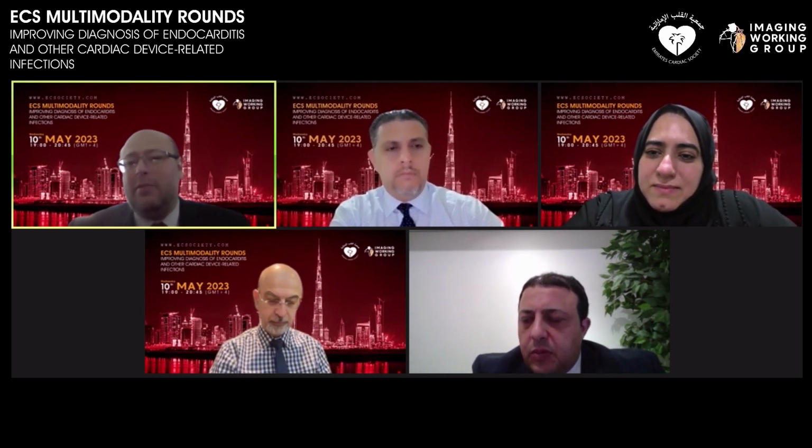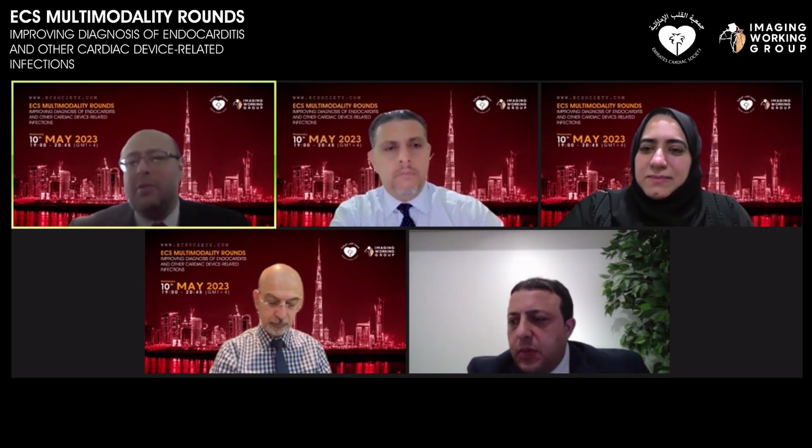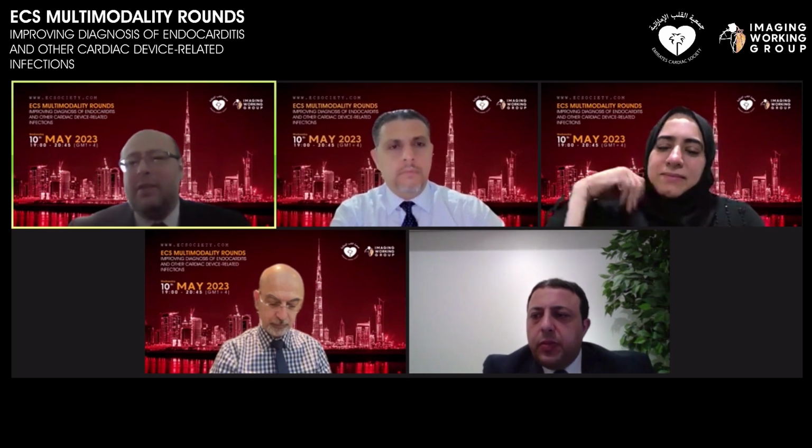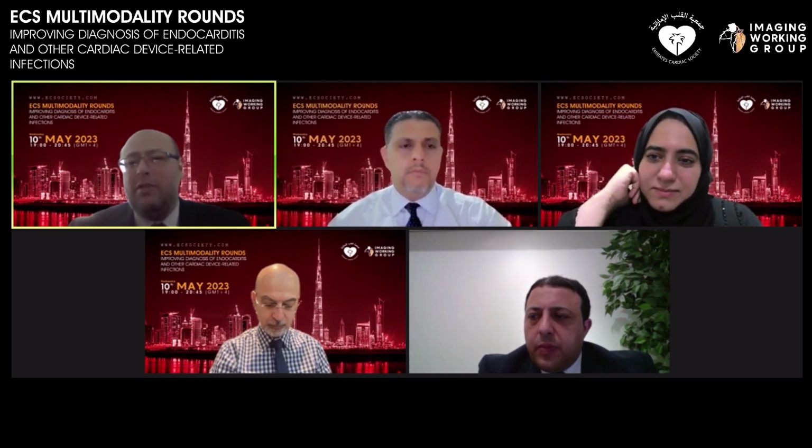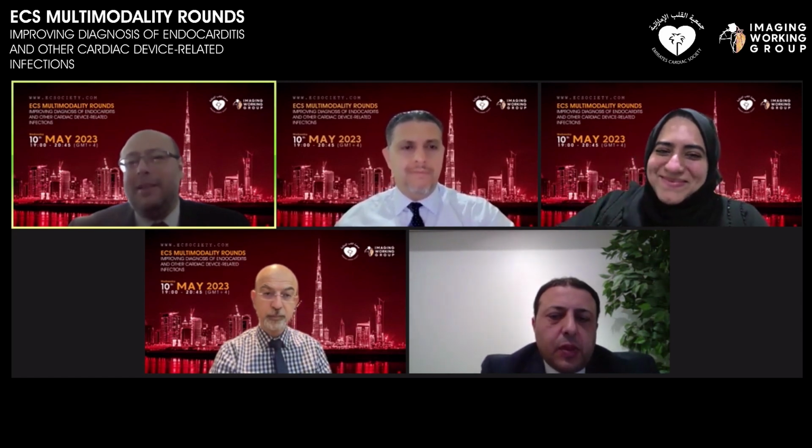So I usually start with a non-contrast retrospective and may or may not do a delayed image. The non-contrast you can even do with less than 1 millisievert just to see where the calcium is. But you need to get a full set of assessment in systole and diastole to make sure that you're not missing anything. Again, these are not just looking for a vegetation or not. Usually the ones that come to CT are looking for what we call goombas. I mean, there is something big there.